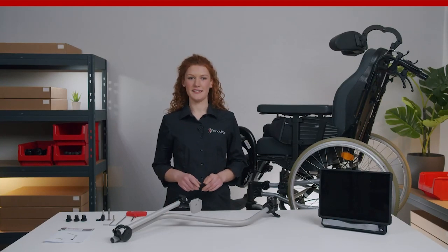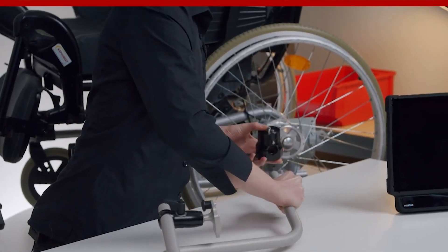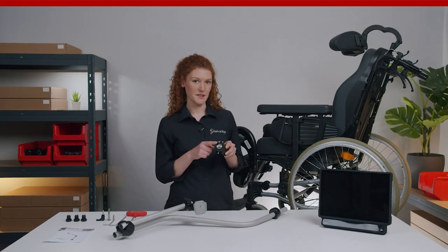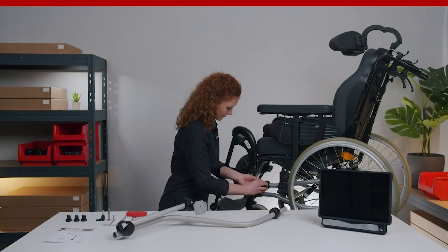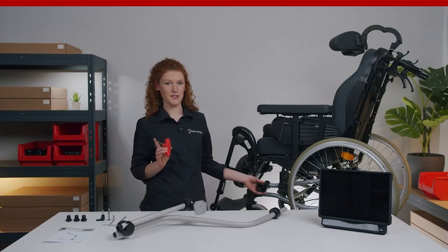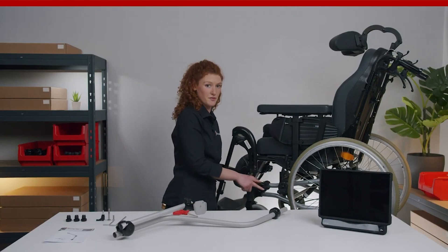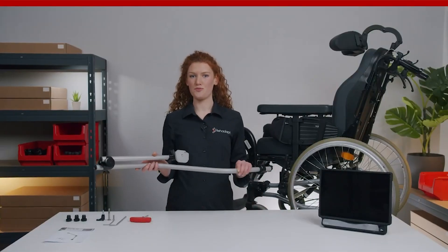The next component we need is the swivel unit with the rotation lock feature. Now let's remove it from the mount. The rotation lock feature allows a safe attachment on the left and the right side of a wheelchair without having the risk of sagging. This pin needs to be connected to one of the four rotation lock holes on the frame clamp. Now use the red T-handle to connect the swivel unit to the frame clamp. Always make sure that the quick shift lever points to the back part of the wheelchair.